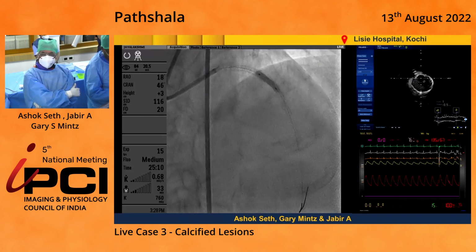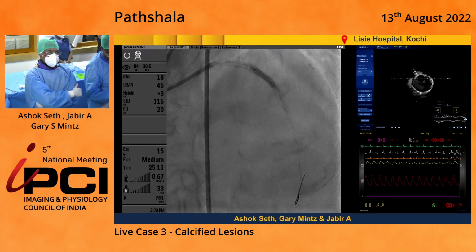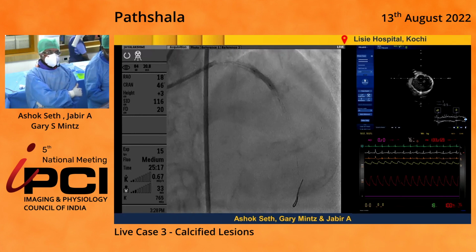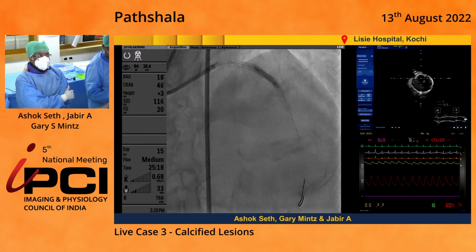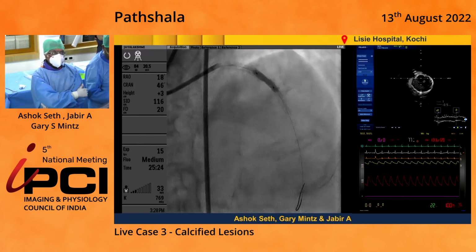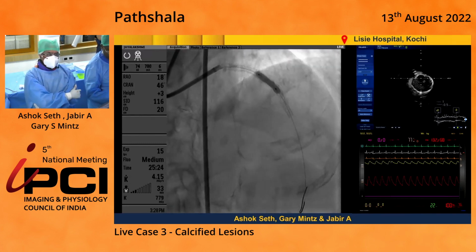Okay, guys, I have an interesting theory here that I'd like to hear your opinion on. 32, 34, 36, 38. What kind of stents were these? And what were the diameters of the stents? And we're now at 40. Well, let's go to 40. Yeah, 40. So we're going to just set at 40 now.